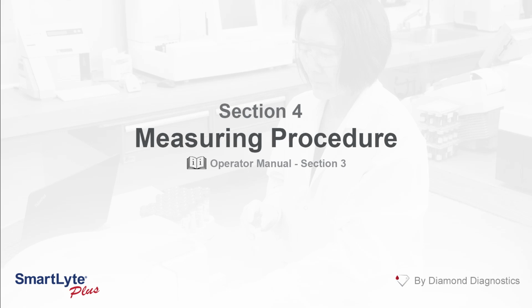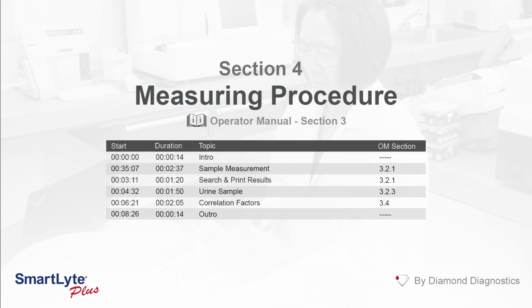Section 4 of the SmartLyte Plus service training will cover measuring procedures. Topics include sample measurement, search and print results, urine samples, and correlation factors.